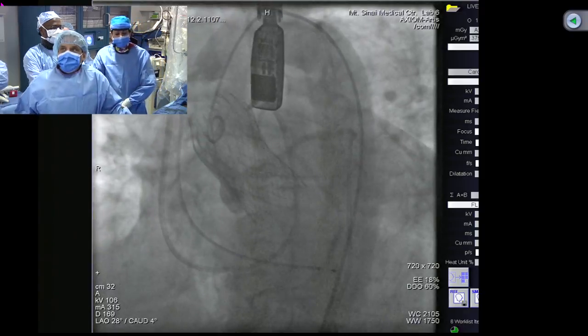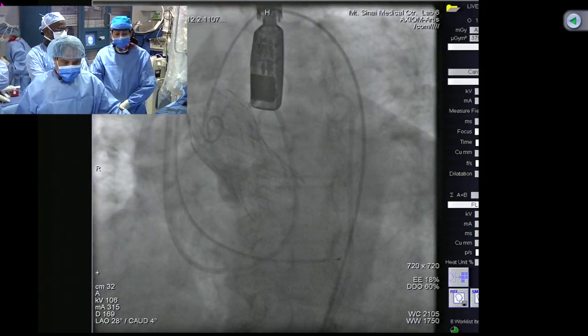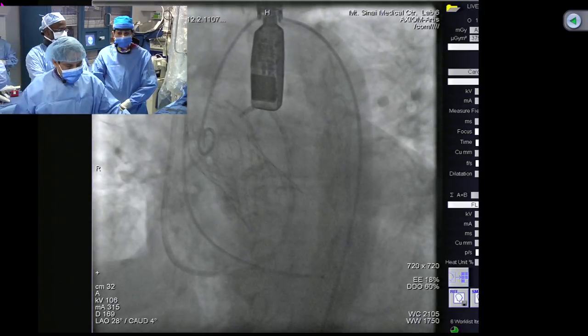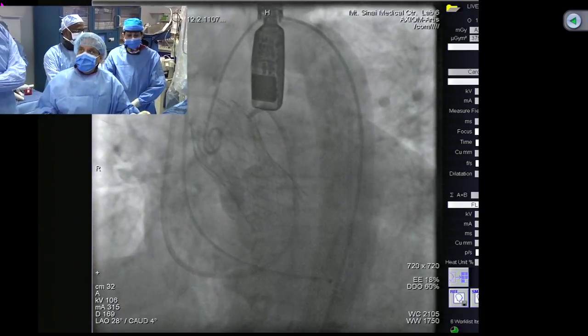Okay, with that note, I think we can quickly go to the usual process. JK, just go through your process now. How are you going to show the angiogram and how are you going to close this now?